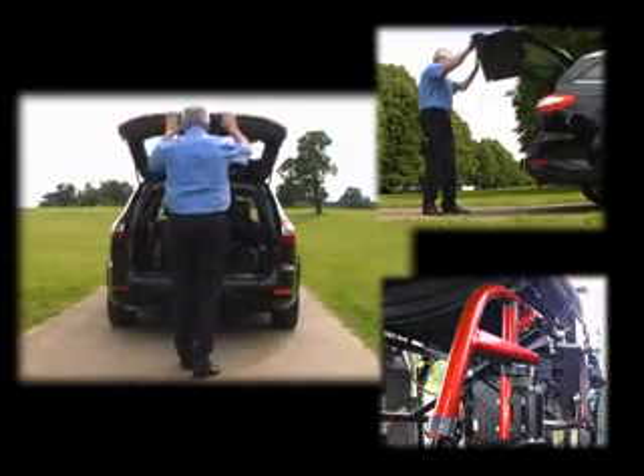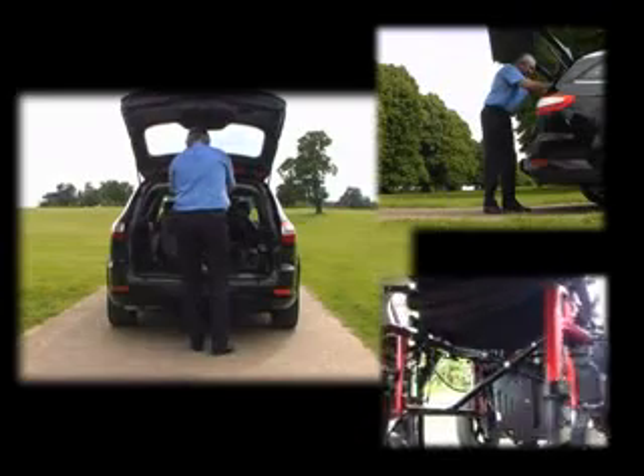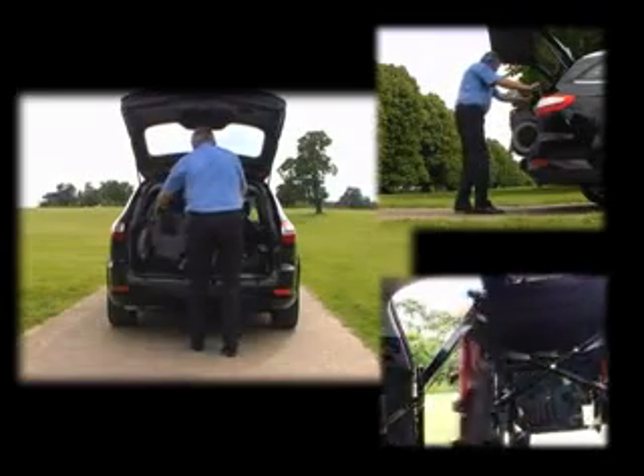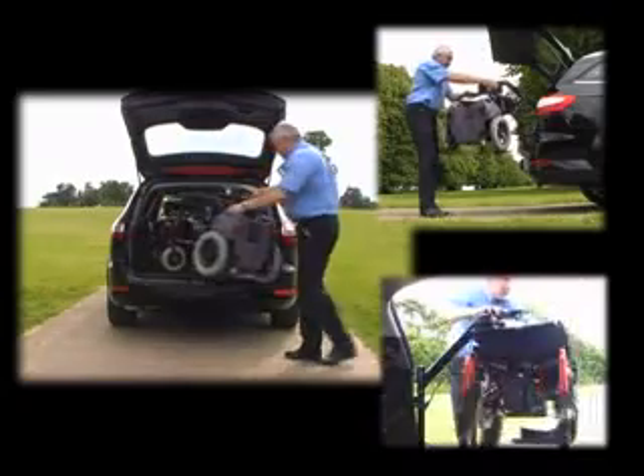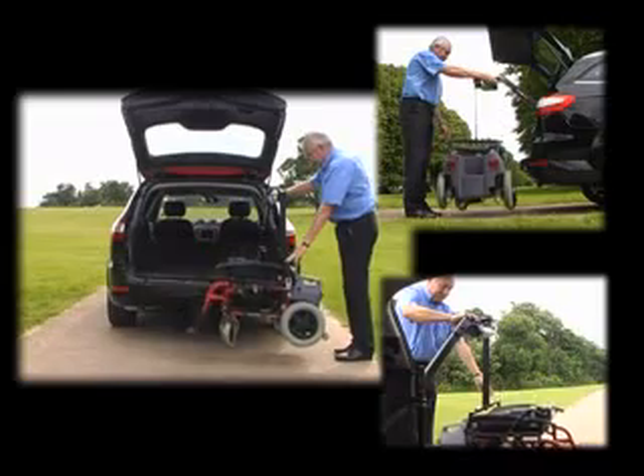This very reliable and competitively priced hoist can be used to lift scooters and motorised or manual wheelchairs of up to 75kg in weight into the back of most vehicles, including MPVs, hatchbacks, estates and some saloons.